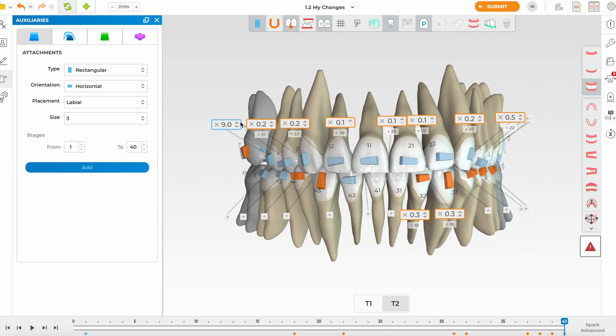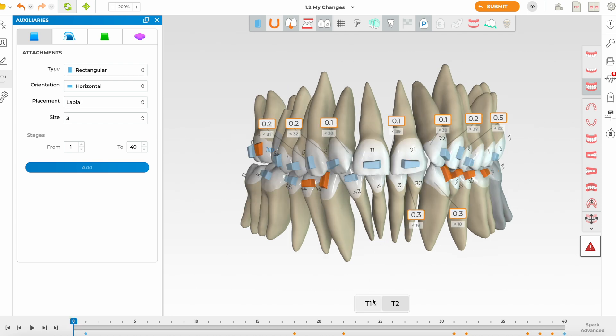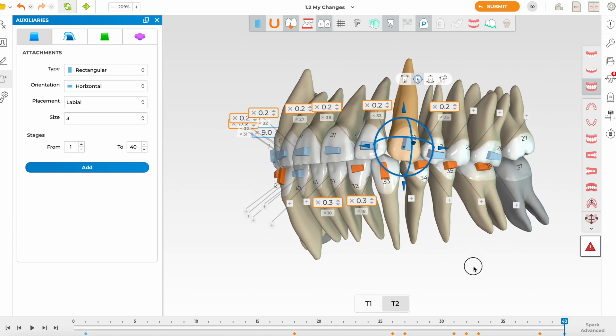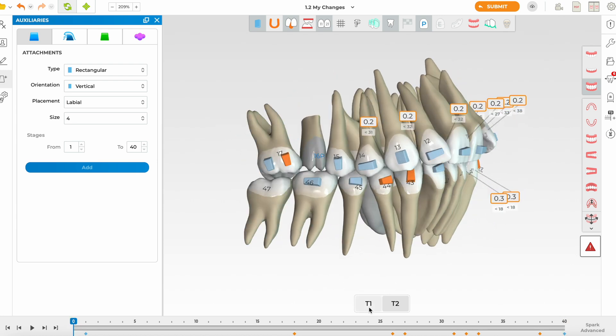Removing the arch overlay and reviewing IPR at T1 and T2 — it's minimal IPR, purely to avoid black triangles. I prefer at least 0.2mm, and the IPR looks quite symmetric, which I like. As I do this I'm also correcting some angulations. For the canine, a vertical attachment is needed — I don't like the beveled one here — possibly a 4mm attachment, which is a good length for a canine.